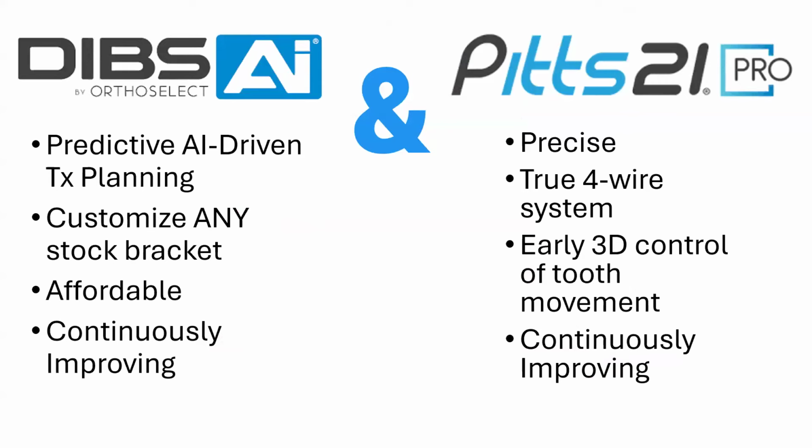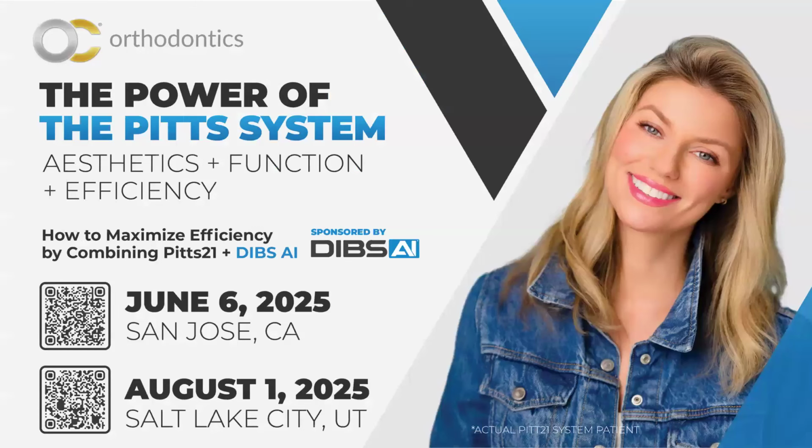I've heard a lot of the consultants say, you know, that the Damon Ultima might be the last mass-produced non-customized bracket ever. I don't believe that. I think Pitts is going to continue innovating. They're going to be bringing new products onto market. I do think they might be one of the only ones. And then eventually things might go custom. But I just love partnering with companies that have that same desire to get a bit better every day, just like I do. And that's what I had to share.